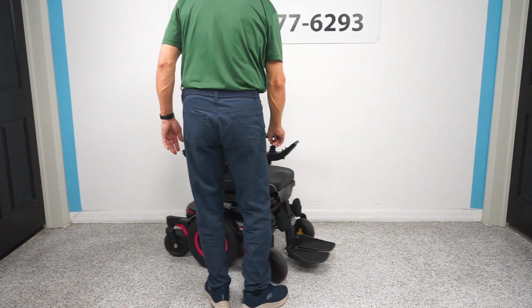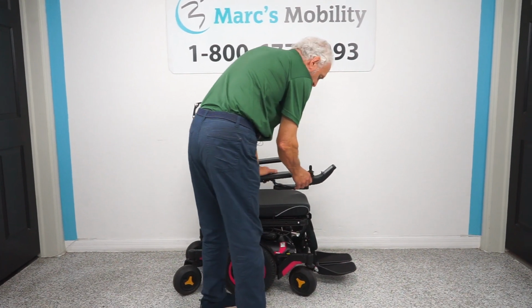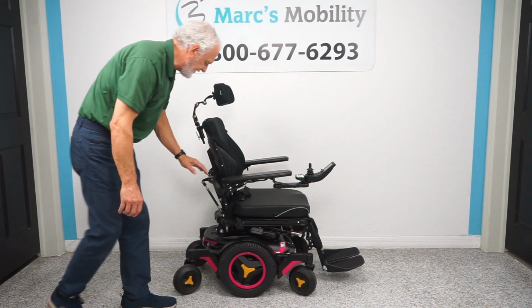Okay. I'm going to put the feet back out. So when we go outside, they'll be ready for outside. There we go. And now we're going to look at the base on the chair.